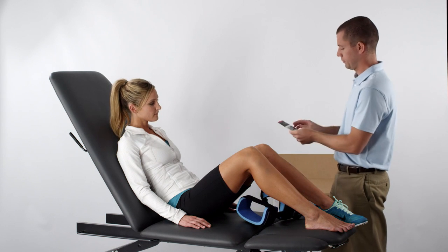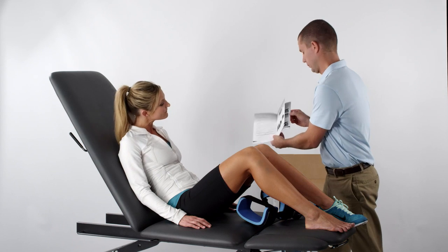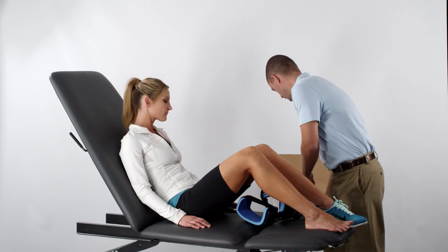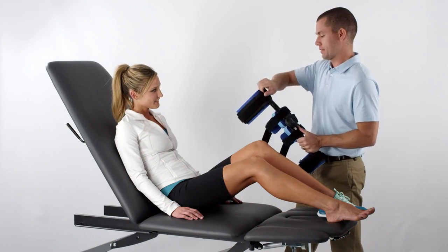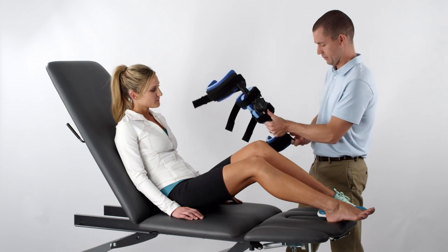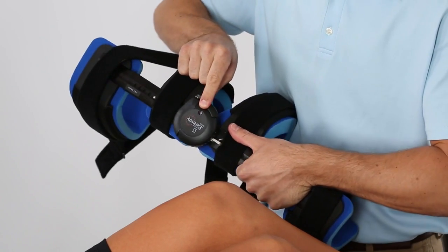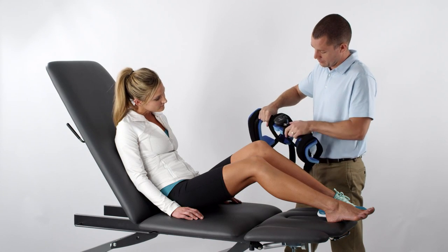Then review the features of the advanced knee orthosis. The instruction manual features a diagram that explains the components and performance benefits of the device. At the initial fitting, unfasten or loosen the adjustment straps on the cuffs. Then check the tension control indicator and make sure it is set at 0.